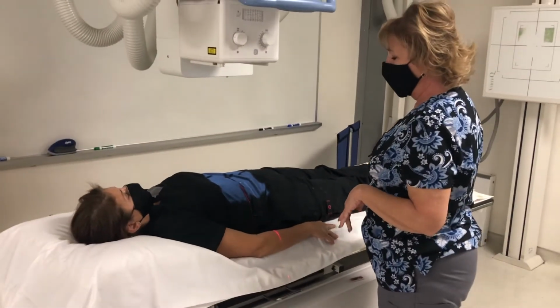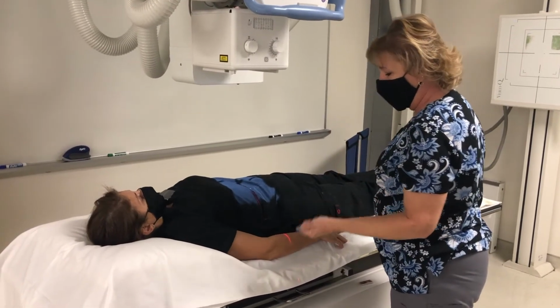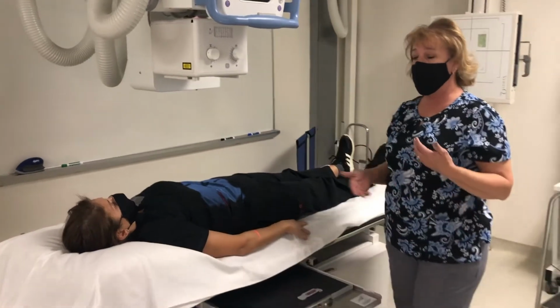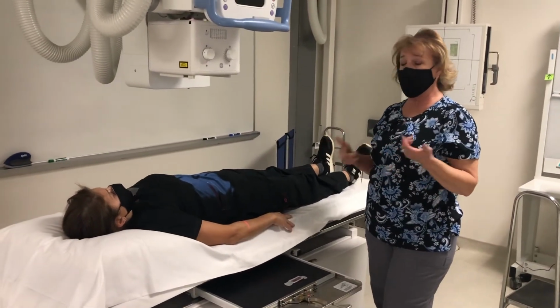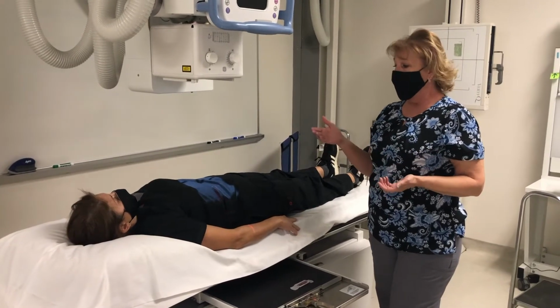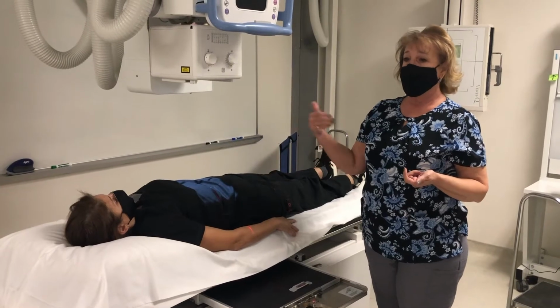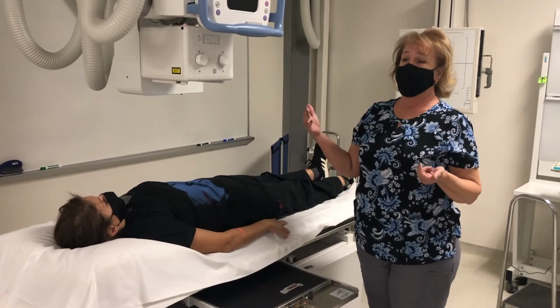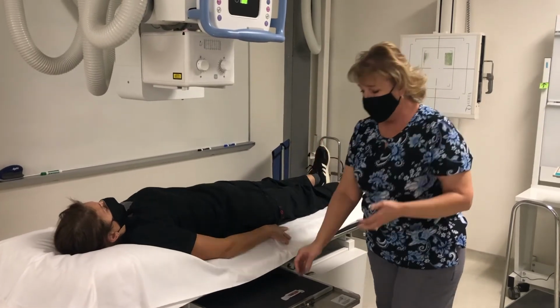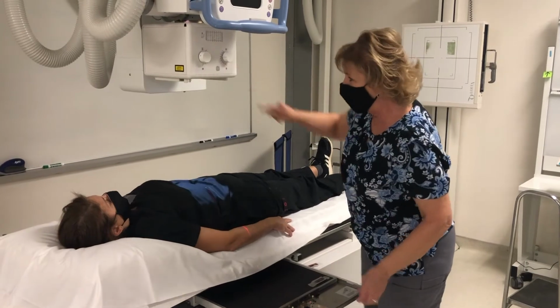So I would do this on expiration, take that picture, and then again, you swap out, and as you watch the clock, you're going to just follow the department protocol, which is usually a 1 or 2 minute nephrogram, a 5 minute, 10 or 15 minute. Generally, by the time you're reaching 15 minutes, now I'm back at a KUB.